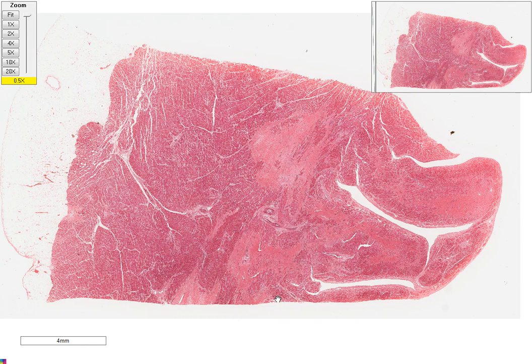So this is an example of healing by repair or by fibrous repair and organization, because the tissue is a permanent type of tissue, so non-dividing, unable to enter the cell cycle, and instead it is patched up by this fibrous scar.